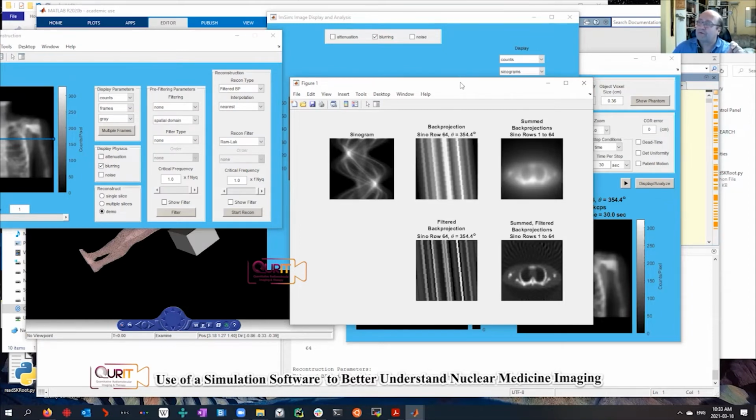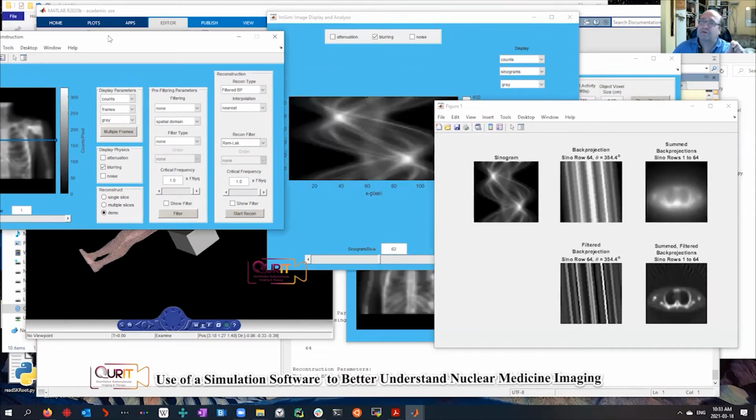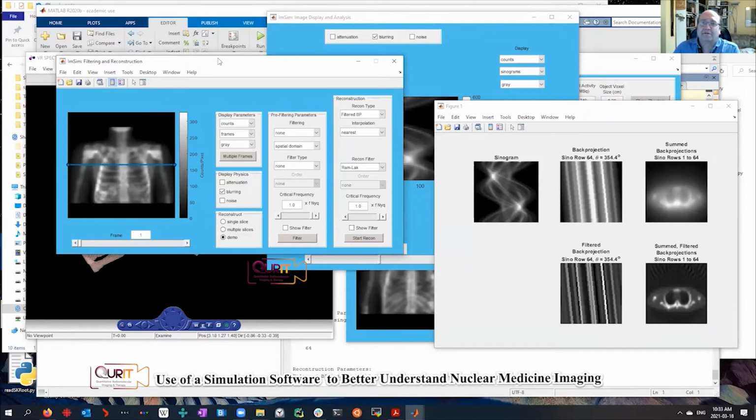Just one thing about the ramp filter, the Ram-Lak filter. The Ram-Lak filter is actually just second-year calculus that people forgot. If you've done second-year calculus, are you familiar with the term the Jacobian of transformation, if you're going between polar and rectilinear coordinates?